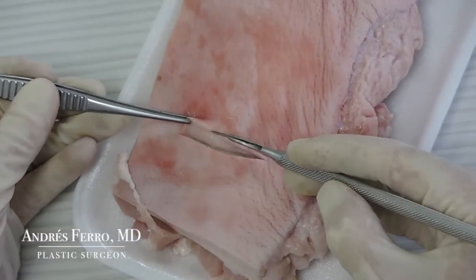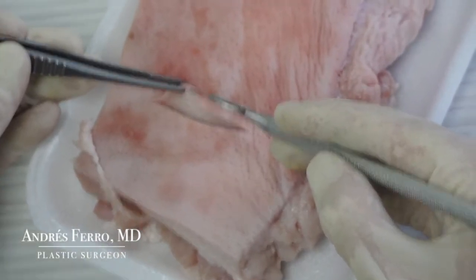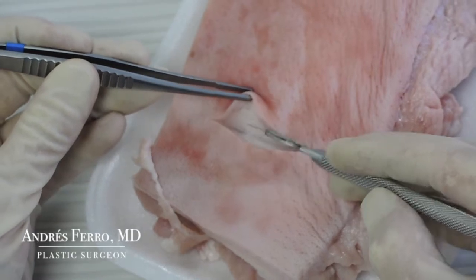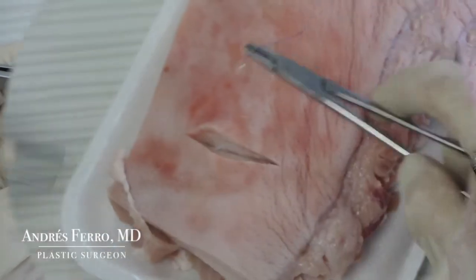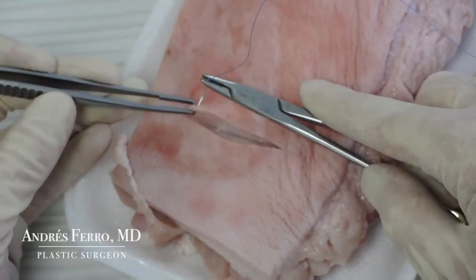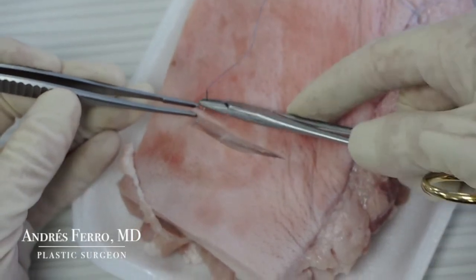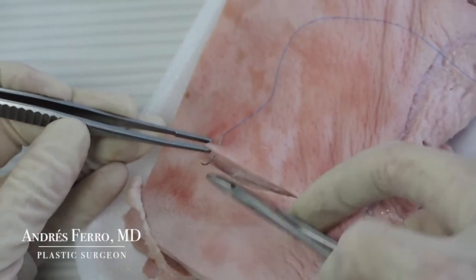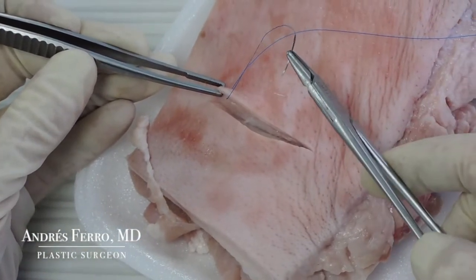Note the thickness of the dermis, as well as the subcutaneous fatty tissue in depth. To begin the suture, mount the suture needle on the needle holder. Secure and present the tissue with the claw forceps. Insert the needle into the epidermis and exit through the deep part of the dermis. Retrieve the needle with the needle holder to do the stitch in two steps.